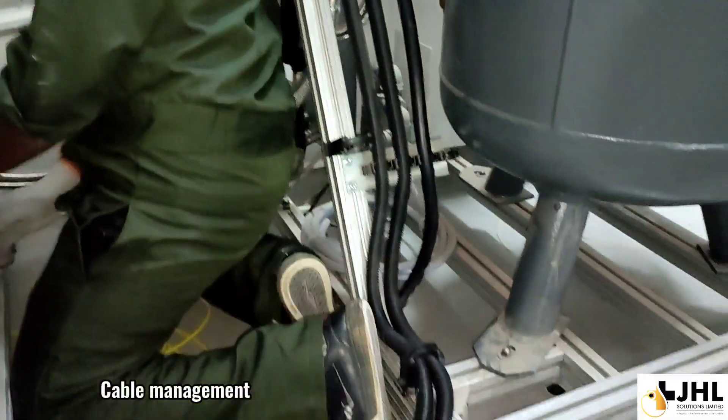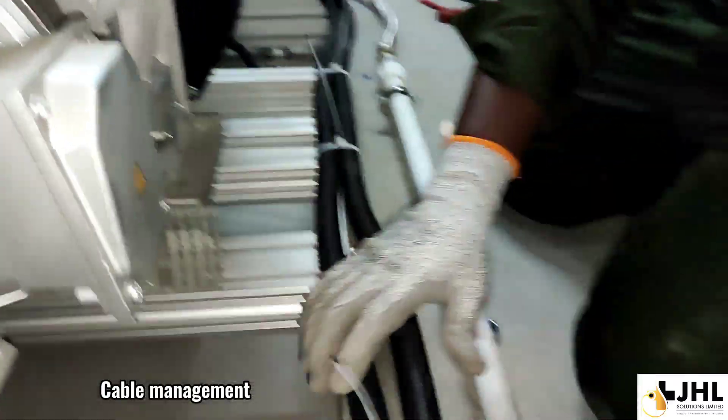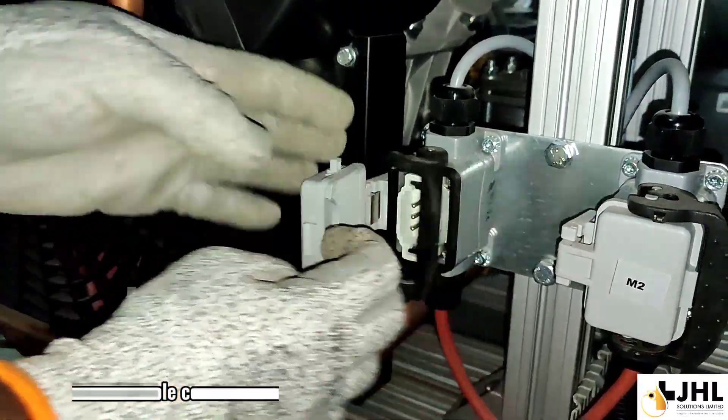Cable management. Motor cable connection.